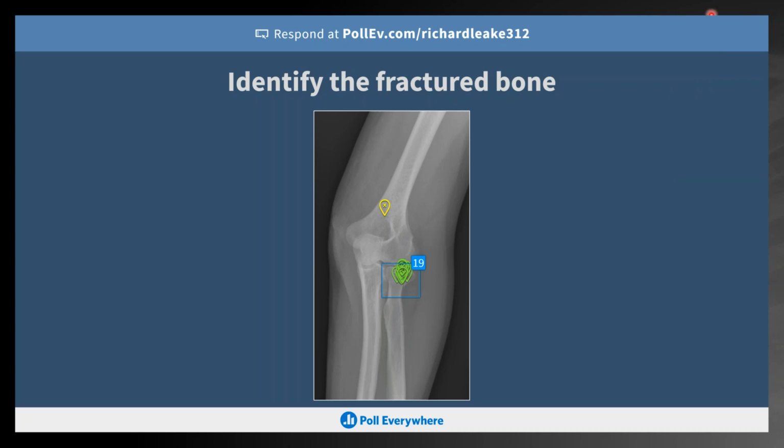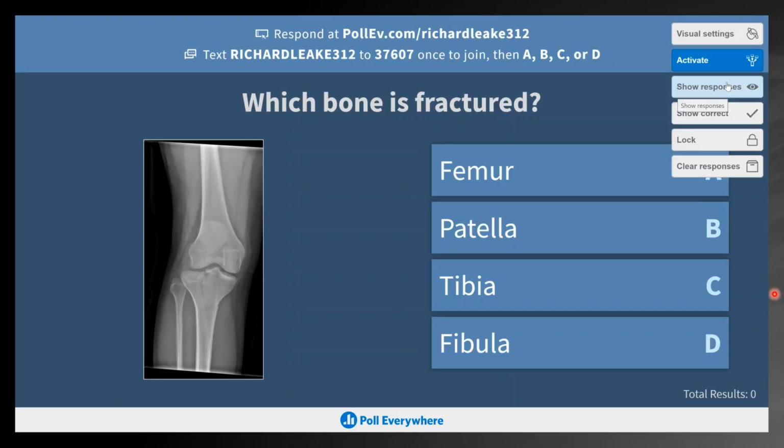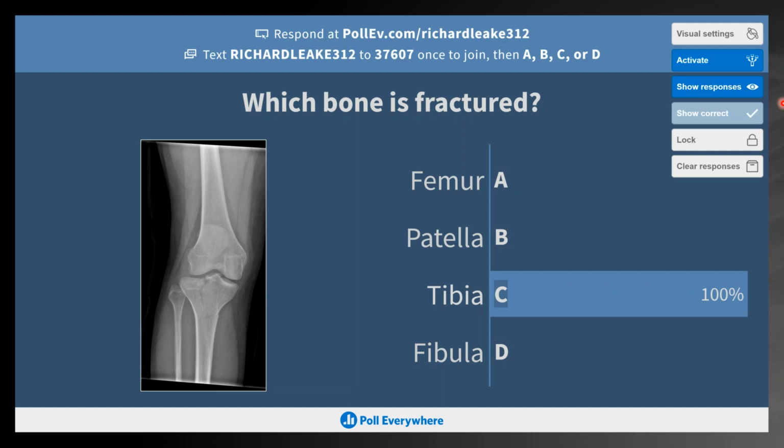Okay, and then last one, I think. Which bone is fractured here? All right, and this is a tibial plateau fracture. That's correct.